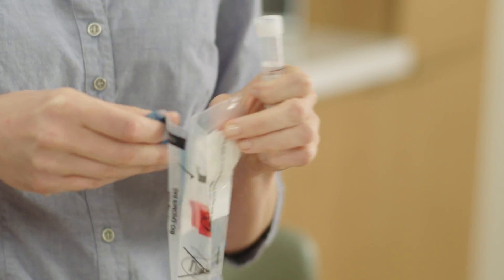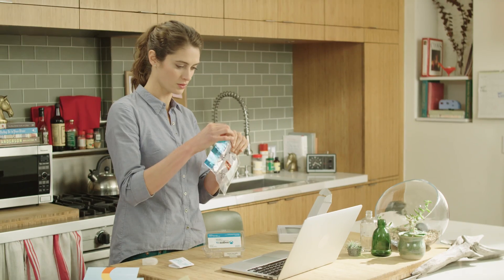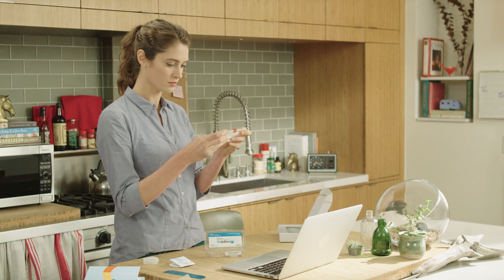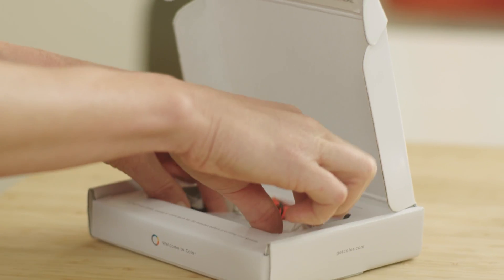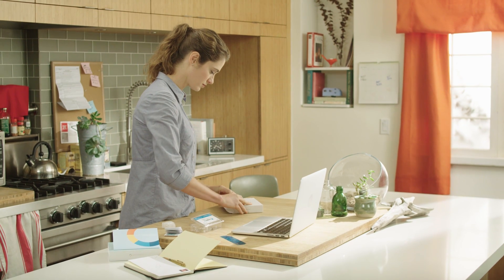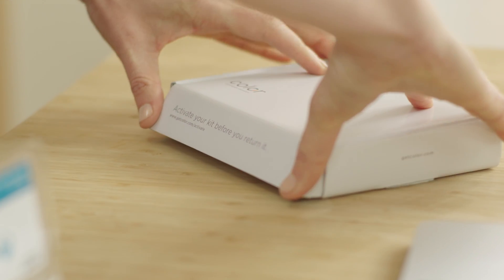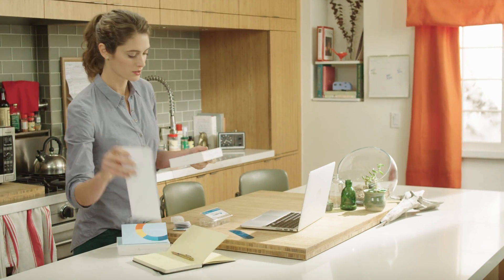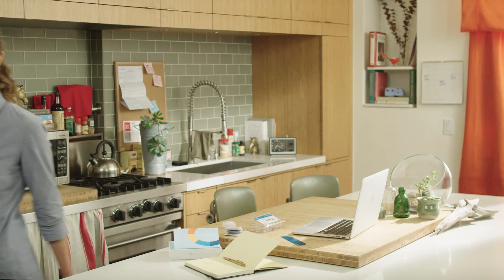Now just send your sample back to Color. Place your tube into the provided plastic bag, seal the bag, then place it back in the cardboard box. Just seal the box and drop it in any USPS mailbox. Your postage has already been paid. Everything else can be thrown away, as long as you have activated your kit successfully. You will receive an email when your sample has been received at the lab and another email when your results are ready.